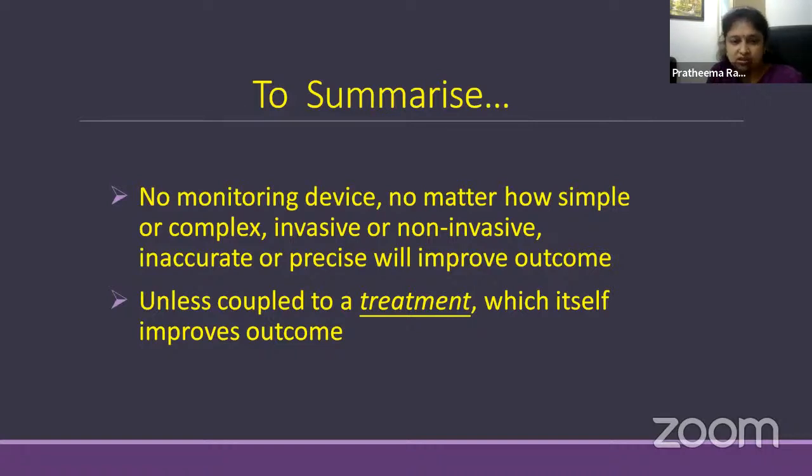And if it is going to be a PA catheter, we must have a very clear protocol for using that, and it cannot be just put in auto mode. There has to be bedside personalized care that is going to improve outcome, and not only the gadgets.